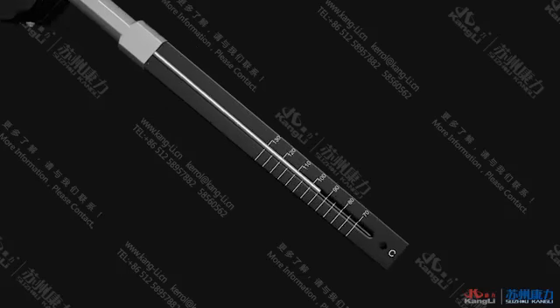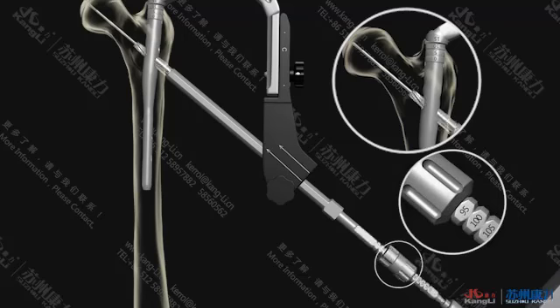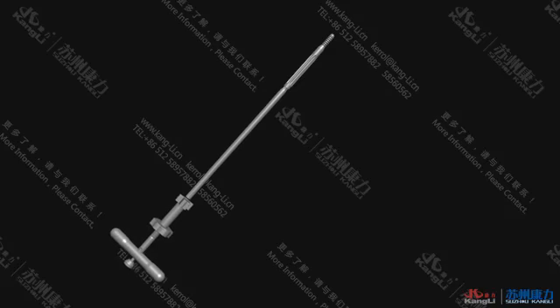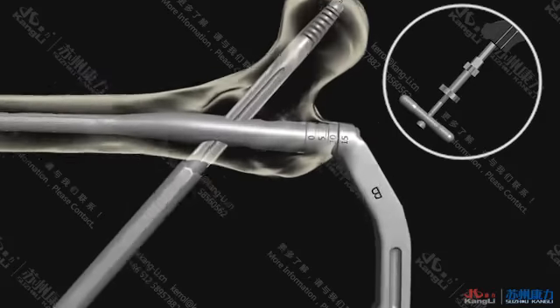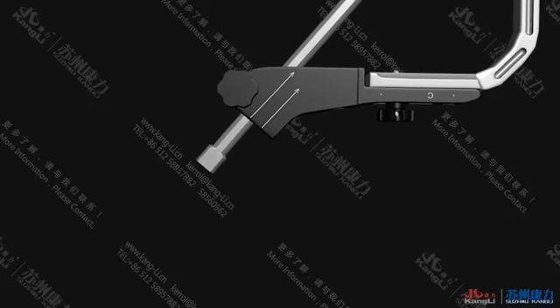Measure the actual length that the Ø2.8 guide pin had inserted into the bone with the leg screw guide depth gauge. Drill the leg screw hollow drill along the Ø2.8 guide pin. After drilling, install a PF leg screw with the appropriate length using the leg screw loader and screw it in along the Ø2.8 guide pin. Remove the Ø2.8 guide pin and check the placement with fluoroscopy.